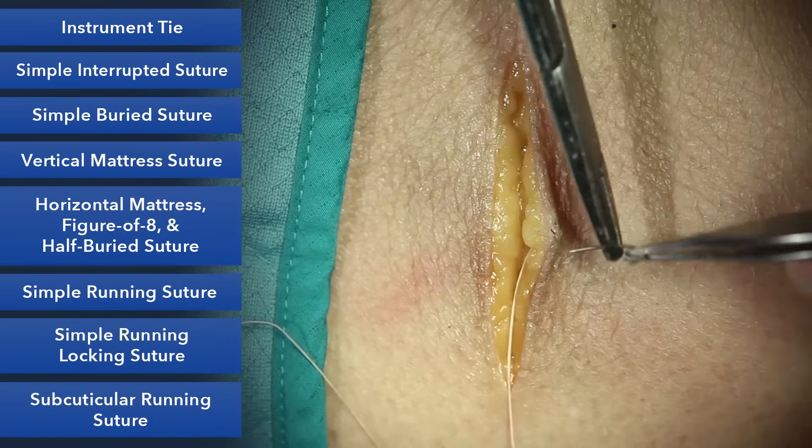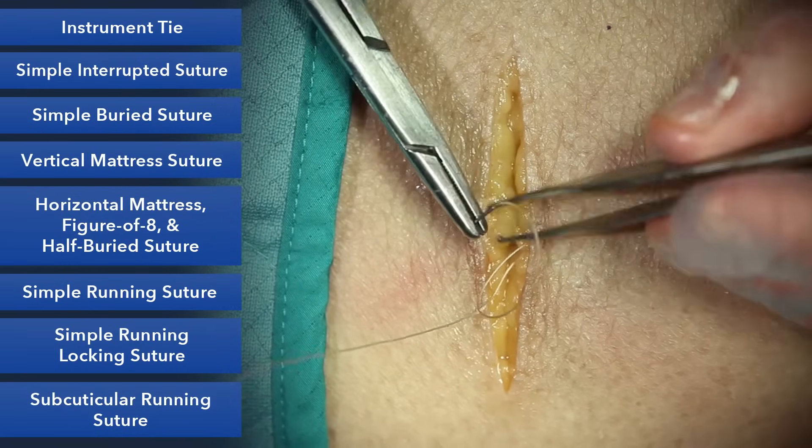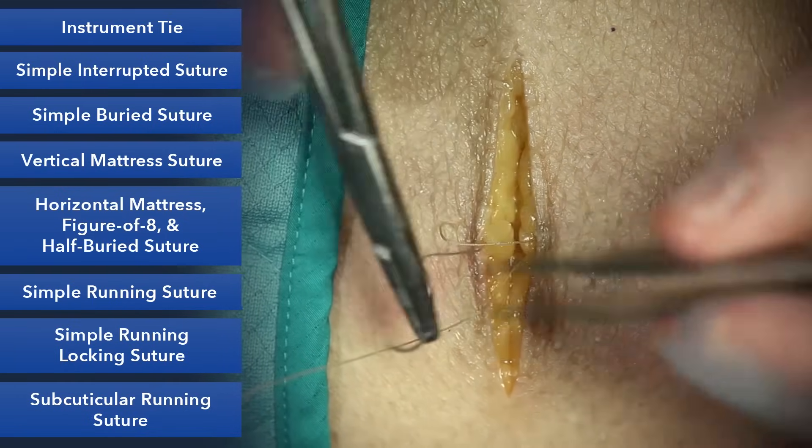On the opposite side, we're going to do the opposite — go superficial and then deep. If you want your knot to bury, it's important that both ends are on the same side of the loop.